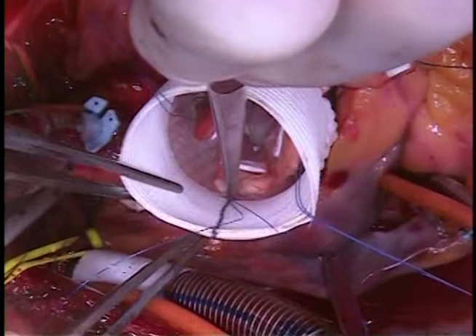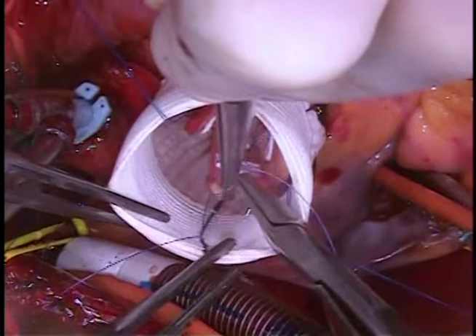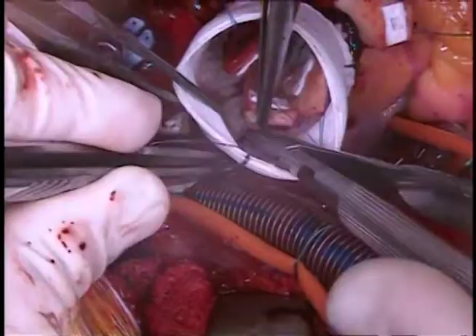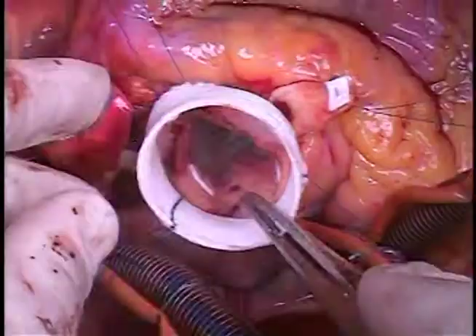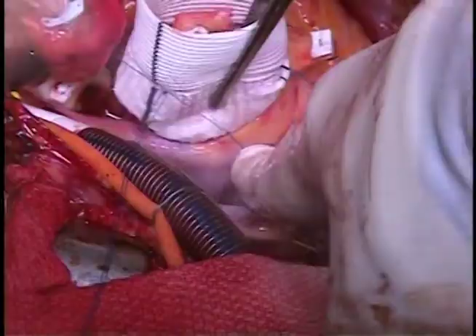Now you're ready to start re-suspending the commissures. You do this by taking the pledgeted 4-0 prolene commissure stitch out through the Valsalva graft right at the top of the neosinuses — in other words, right where the sinus portion of the Valsalva graft meets the straight portion. This is a nice feature of this graft as it simplifies the process. The graft is designed to minimize variability, and in our experience we have very rarely strayed from this landmark. We snap the sutures in place, examine the entire construct, then tie them with three to four knots.